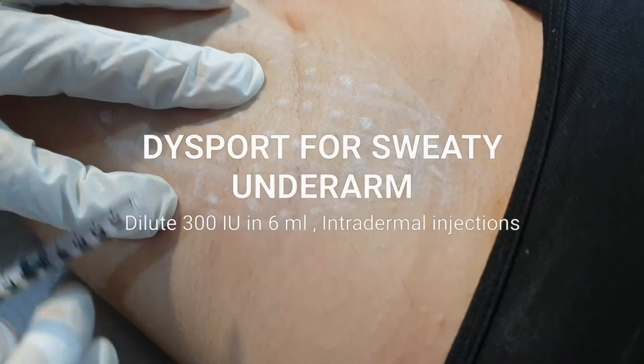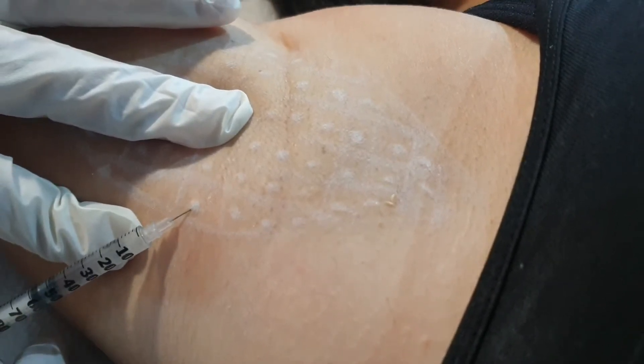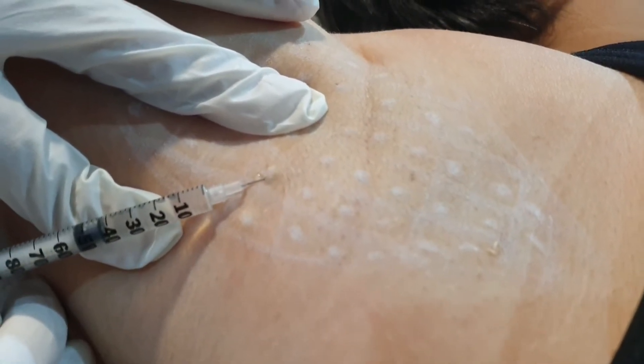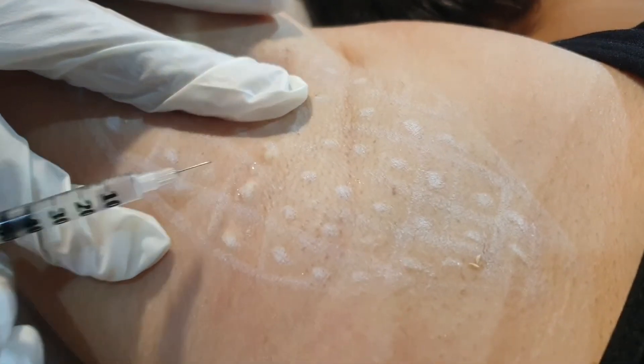Here is intradermal injection — you have to see the bubble. In each point, just a small drop, like that. In each point, a small drop, around 1 to 1.5 cm.